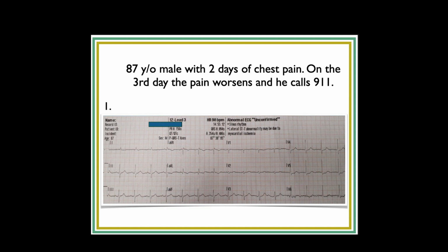But what do you notice after, if you can see it? Again, it's more of the same, so you should be able to guess what it is, even if you can't quite see it. What does AVL look like? What's concerning there? A little bit down, and what else? Tiny bit of what he called sagging, and what else is there? What was the other thing to look for in AVL? Yeah, it's a flip T. It's that exact pattern that he drew out.